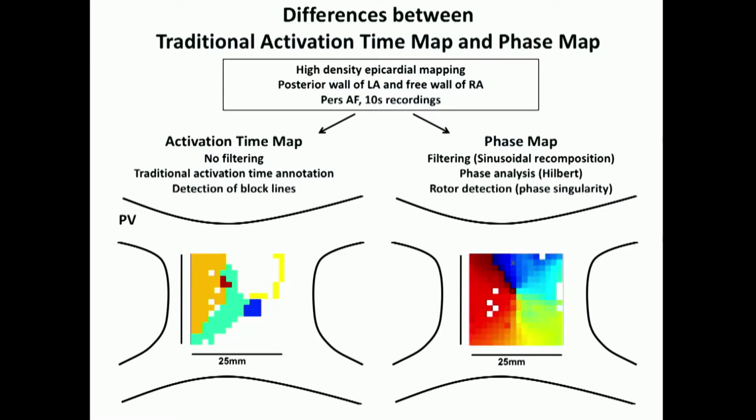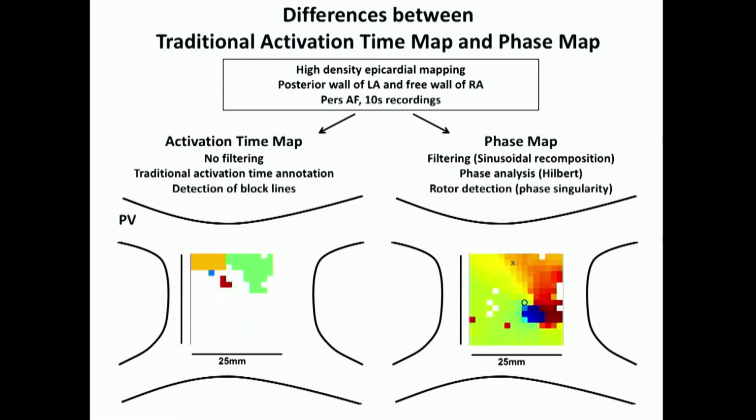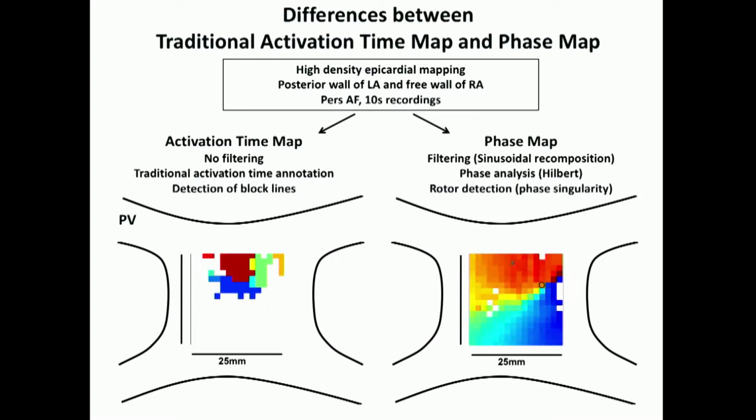The first thing you see is that it looks very nice. It is simply a very beautiful thing to look at, and you know there is literature and knowledge about the relation between pattern recognition and aesthetic perceptions, so that may already be a psychological substrate towards rotors. But anyhow, when I run this now again, I would like to ask you to have a look at two different aspects of this. One is that the phase singularity you see here is sitting on a line of block, and the other thing is, of course, that the entire perception of the entire process is changing a lot.